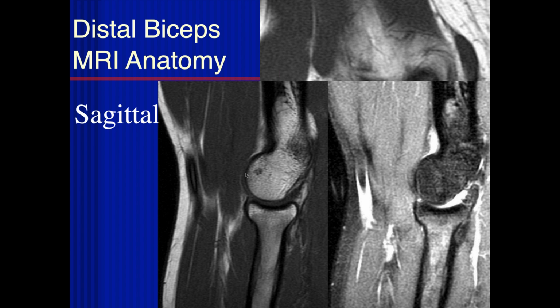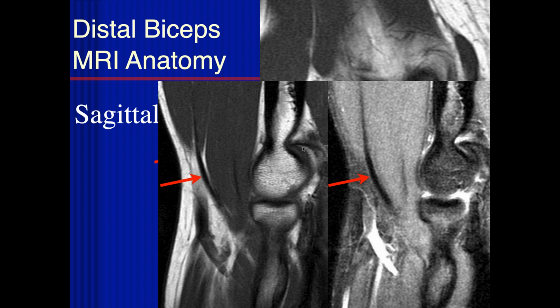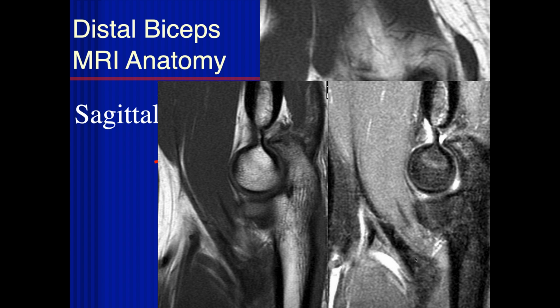And in the sagittal plane, brachialis, biceps tendon coming down here. This is a vein. And then you can follow the tendon coming all the way down here to its attachment on the radial tuberosity here. On the other side, this is the brachialis.